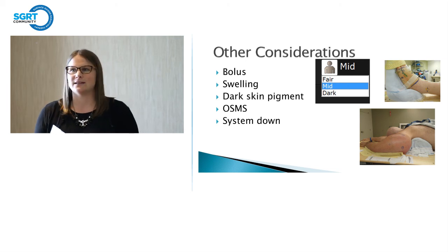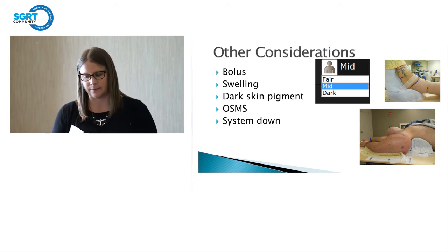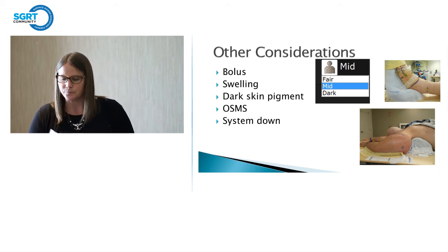For photons, that's not a super big deal because you're able to still cone beam and align to that soft tissue. We don't have to replan these patients generally. You're able to make adjustments to compensate for that.